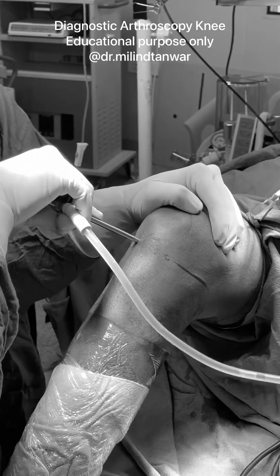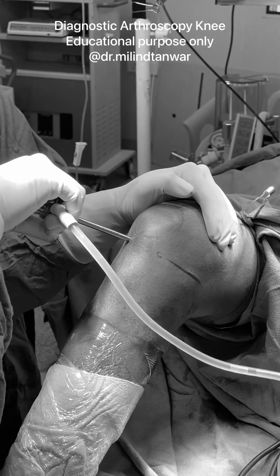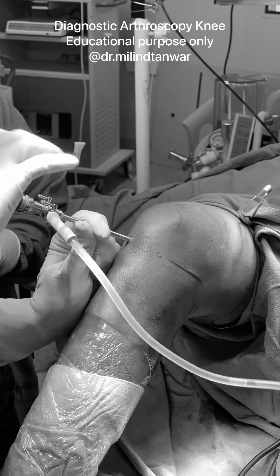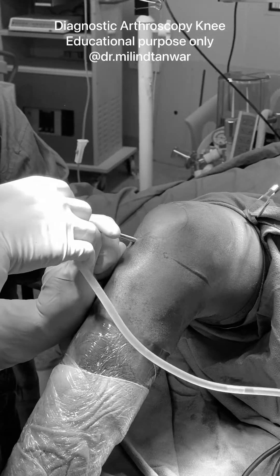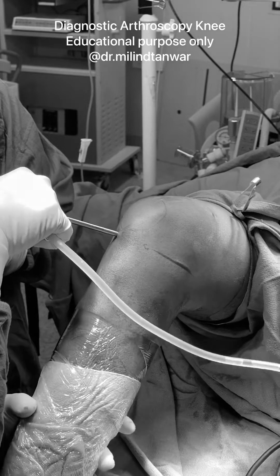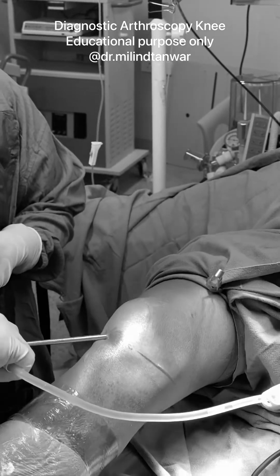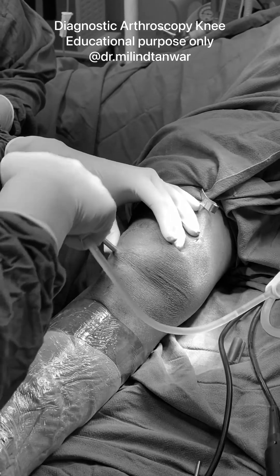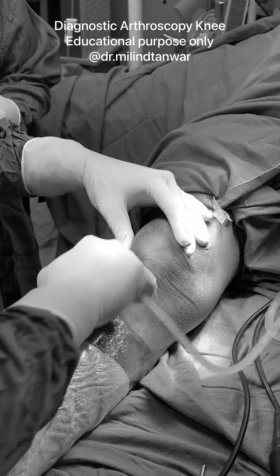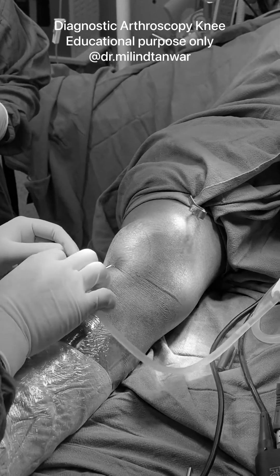You have to insert your trocar first. There will be a certain give-way and you have to be directed towards the notch. After that you have gone into the suprapatellar space. Once in the joint, slightly retract, take this out, extend the knee, and try to go into the suprapatellar recess. Once in the suprapatellar recess, you can see the trocar is positioned there.